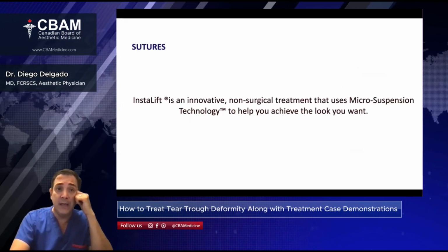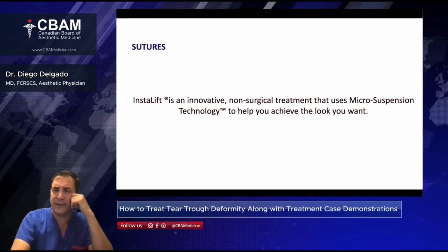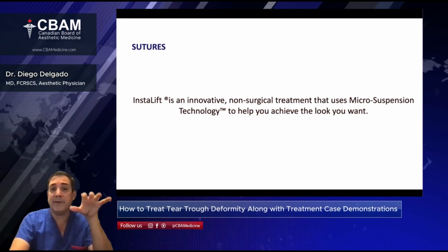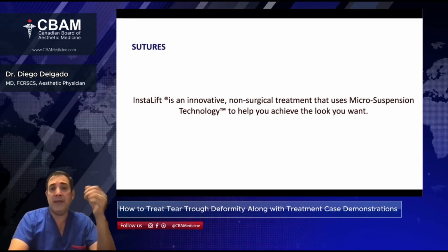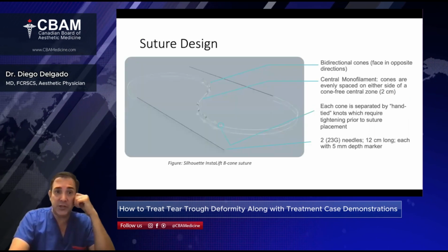And then finally, sutures. And I mentioned this because this has been Health Canada approved for now a year and a half. These are an innovation which consists of microsuspension technology that can help your patients to achieve a nice lift and with minimal volumization.